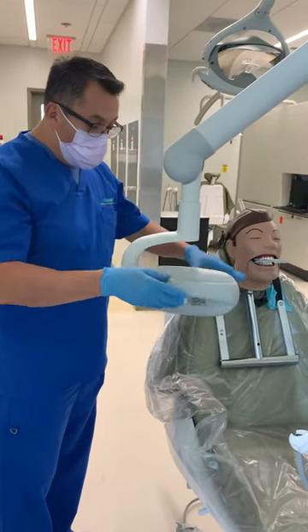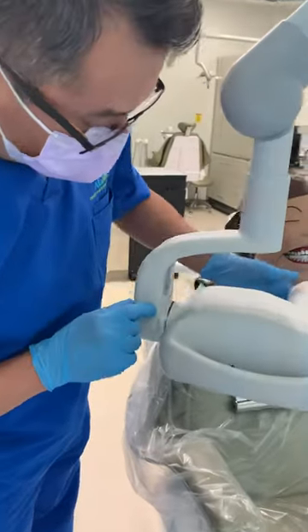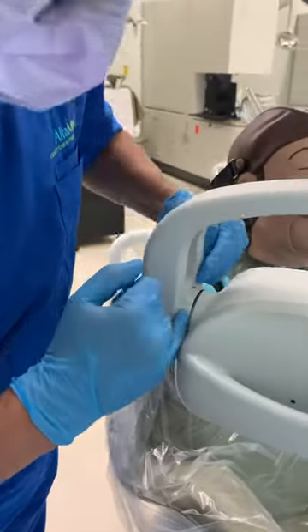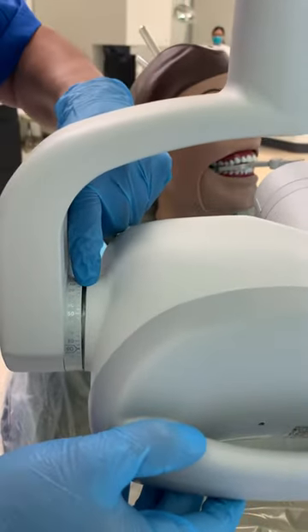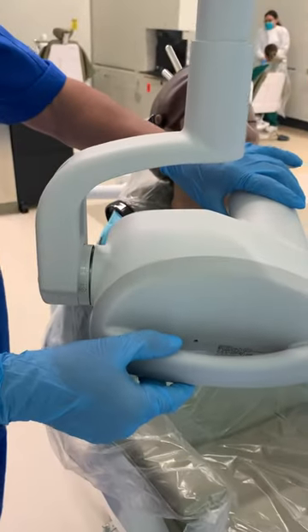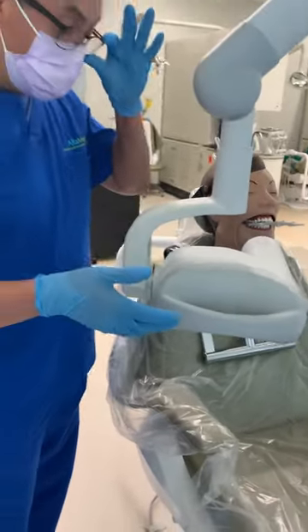Real quick, I'm going to show you on this PID. If you come closer — all machines have degrees marked, and all machines have a little line to mark the degrees. So right here, what you have to make sure is that you follow this, especially if you're new to taking x-rays.